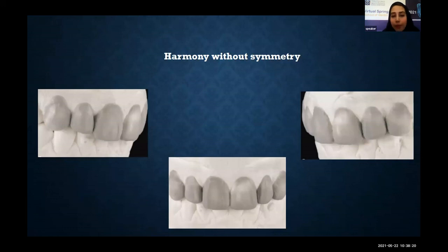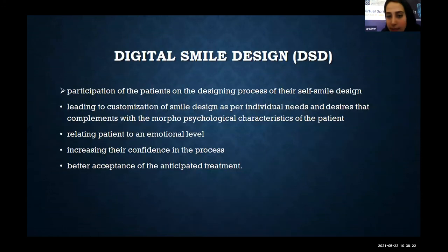Okay, in digital smile design, or DSD, we do smile designing in software. It has some advantages. The first one is participation of the patient in the designing procedure, which leads to a customization of the smile design for each person according to her or his needs and desires, in complement with the morphopsychological characteristics of the patient.